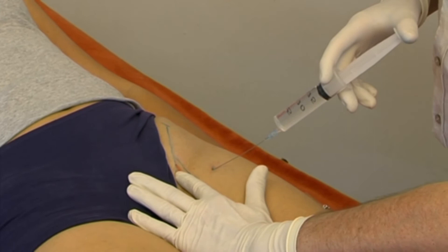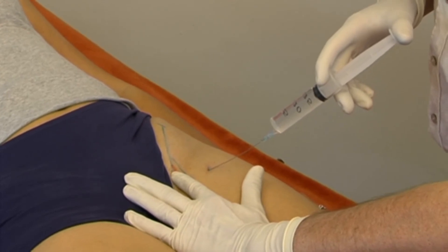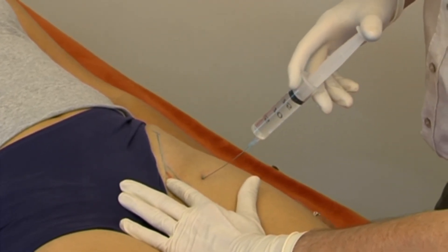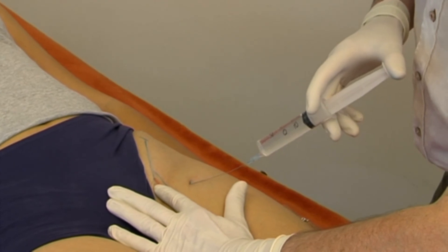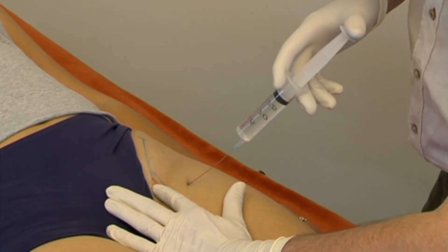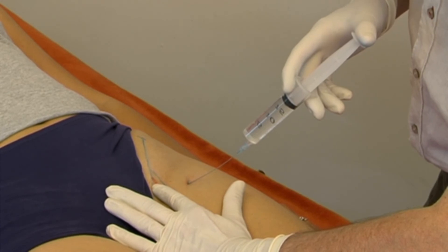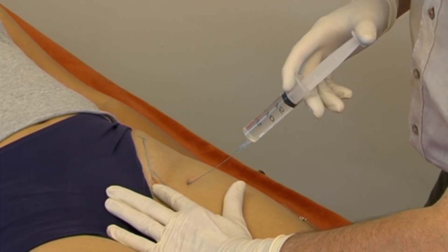After bone is felt, the needle is withdrawn a few millimeters until its tip lies outside the articular capsule. Here the infiltration begins. By repeated withdrawals and reinsertions of the needle in various directions, the space between the hip joint and the psoas muscle is infiltrated, while constantly checking the pulsations in the femoral artery.